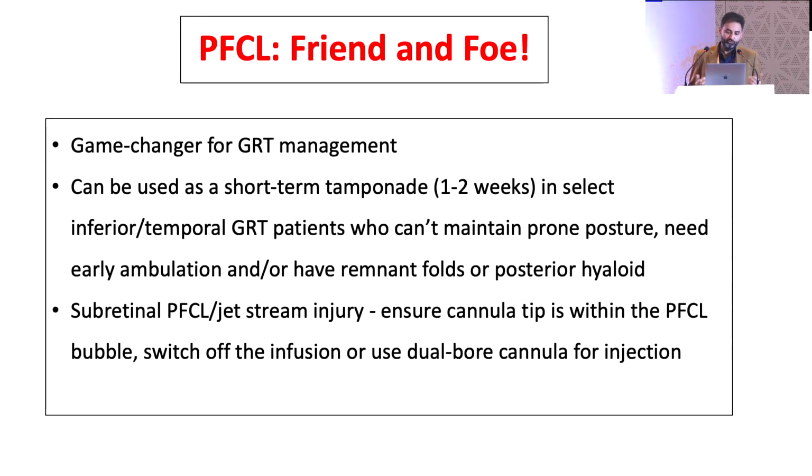It can also be used as a short to intermediate term tamponade, as Dr. Raja might say, even as a sandwich technique for time immemorial. My take on that is not as favorable as his. However, you have to be mindful of it going under the retina, of you causing high pressure.